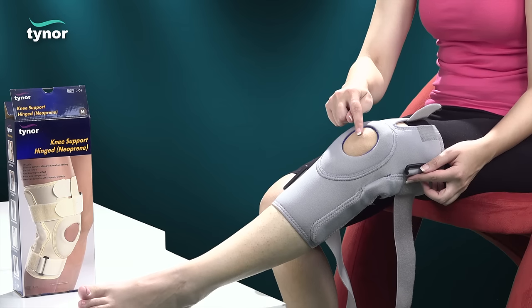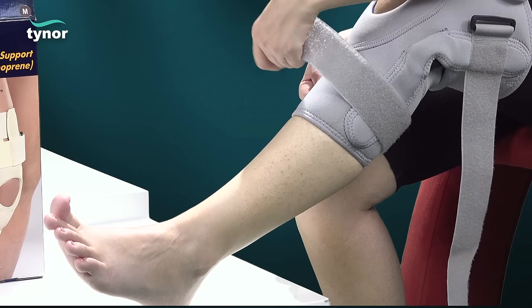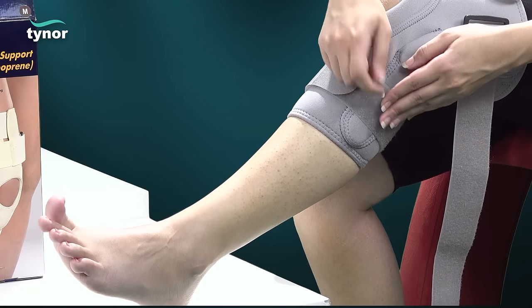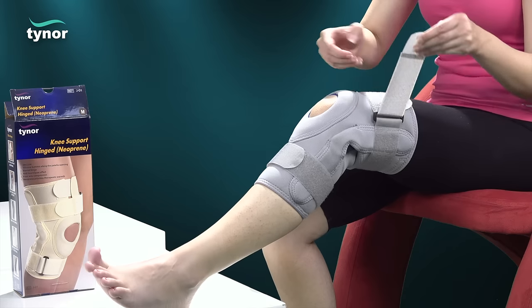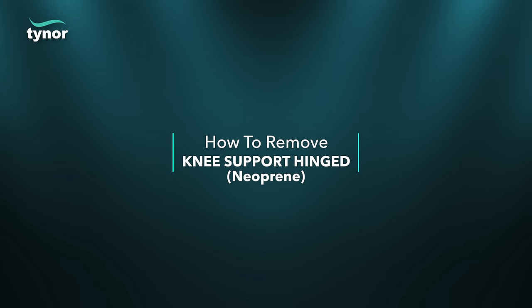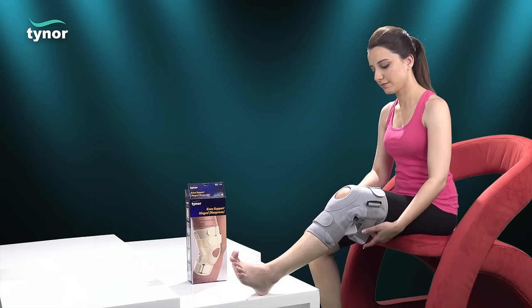The patella should align with the patellar window. Fasten first the lower and then the uppermost strap for a comfortable yet effective fit.